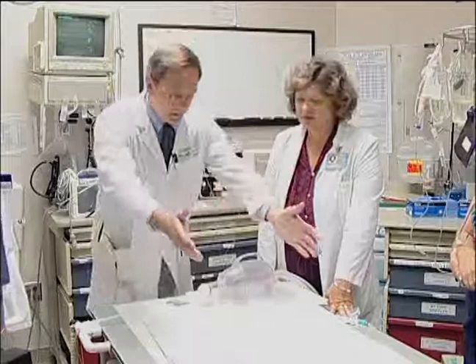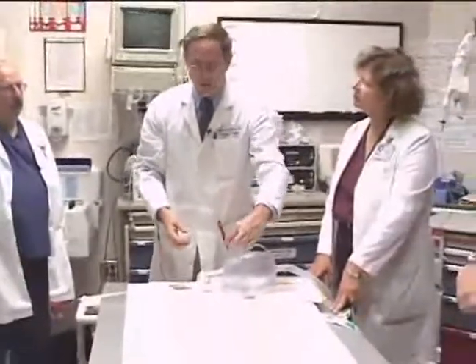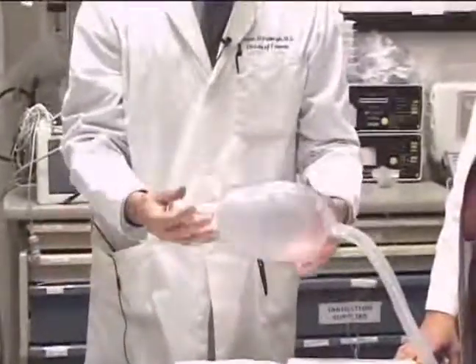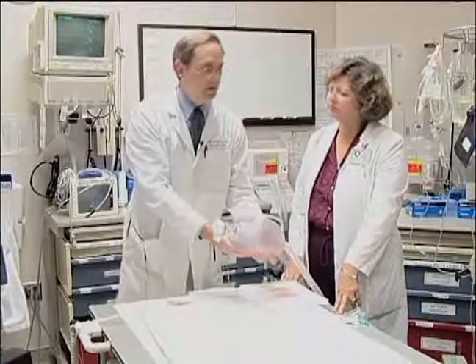At that point, we place the patient in inline stabilization. That being, if the patient is laying here with the head, one of our doctors will come to this side of the patient and lie down and actually stabilize the patient's neck. We'll take the anterior aspect of the cervical collar off. Someone will apply cricoid pressure, and then we'll go ahead and assist them with the ambu bag. Now at this point, we've not given any drugs at all, so all we're trying to do is stay with the patient's ventilation. When they inspire, we assist them.